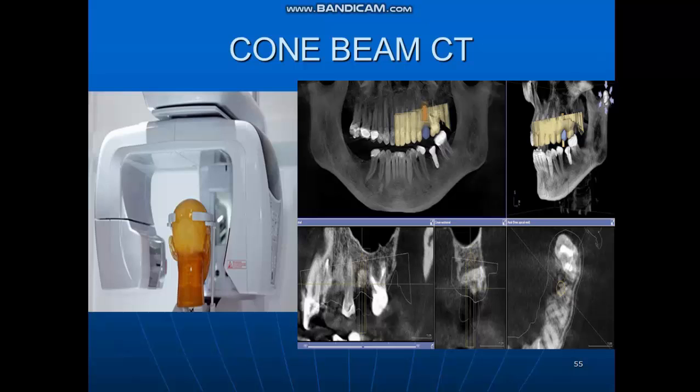These data are used to reconstruct a three-dimensional image of the following regions of the patient's anatomy, such as dental region, oral and maxillofacial region, including mouth, jaw, and neck, and ears, nose, and throat.